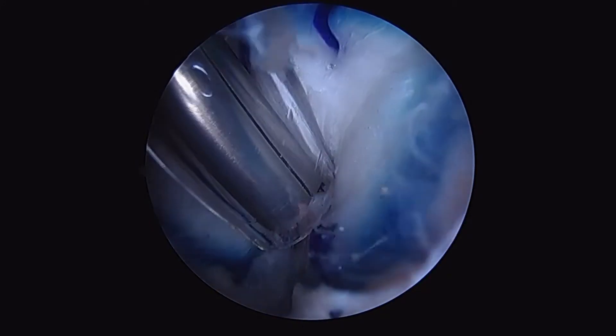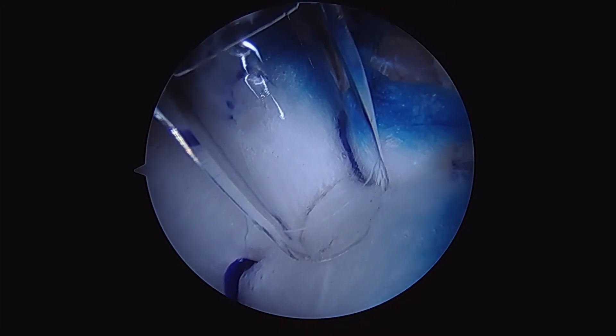Here you can see we're pushing the graft down into the position we want. We can rotate it, and then we'll insert our staple to secure that position. We're utilizing the trocar as well as the staple inserter to push the graft down into the position we want.